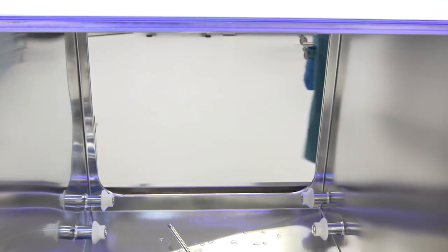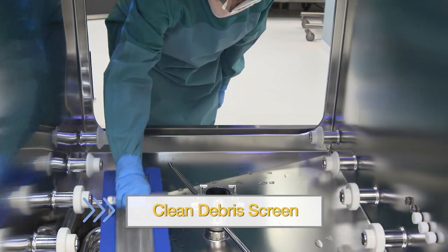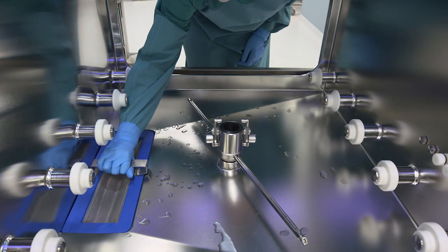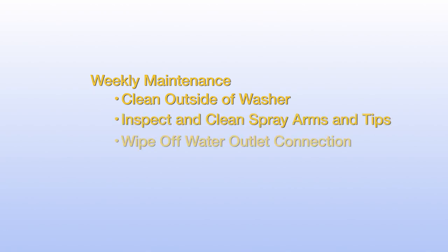After the last cycle has been completed each day, you'll need to rinse off the debris screen. Remove the debris screen and rinse it under running water, then replace the debris screen. Once a week, you'll need to clean the outside of the washer. Inspect and clean rack spray arms and tips. Wipe off the water outlet connection. Run the decontamination cycle.